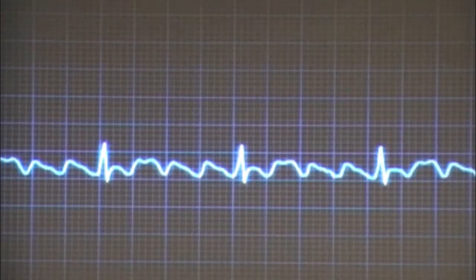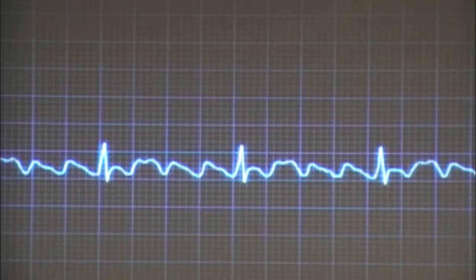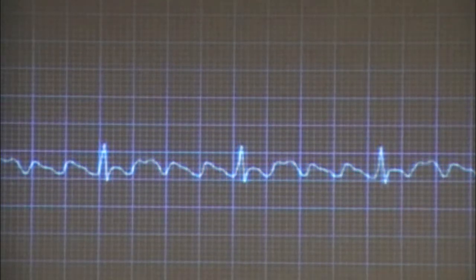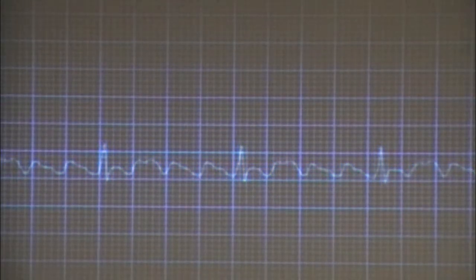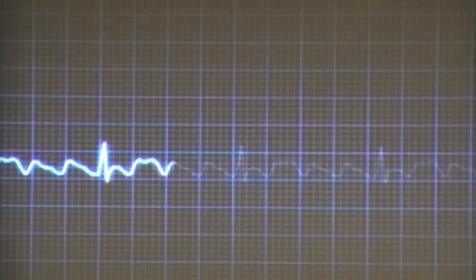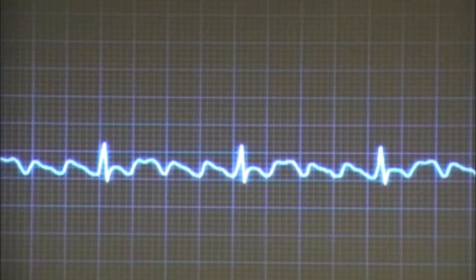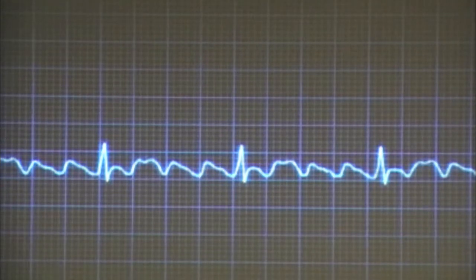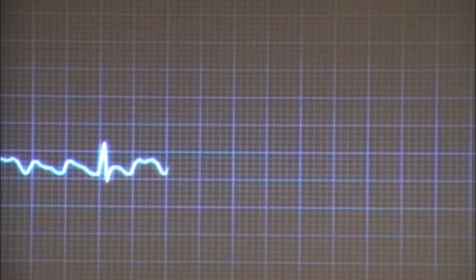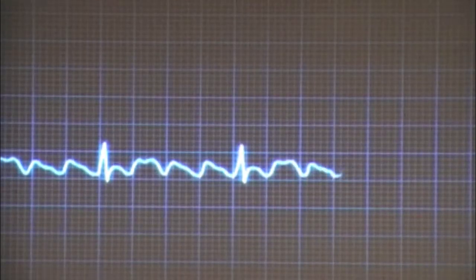I love this rhythm — I love those F waves, sawtooth picket fence waves. You can paint a fence, but you can't paint the EKG. This is atrial flutter.